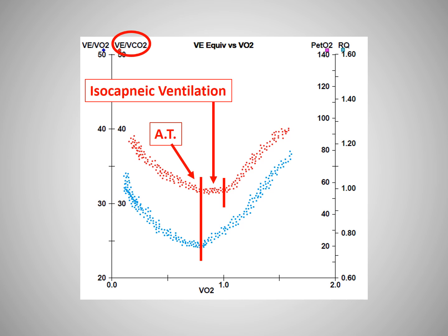Soon, however, the acidosis generated is greater than the ability of the lungs to fully compensate, resulting in the minute ventilation, or VE, rising excessively in relation to the VCO2, causing the slope of the VE to VCO2 to start to rise rapidly, just like the VE-VO2 tracing.